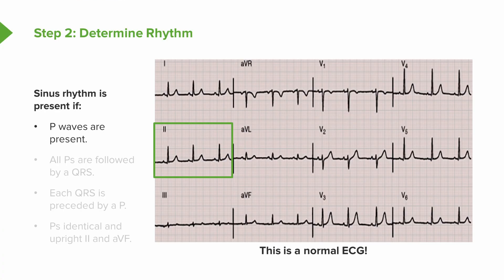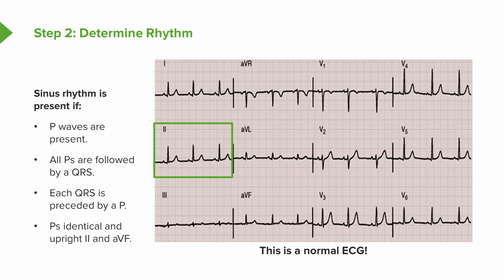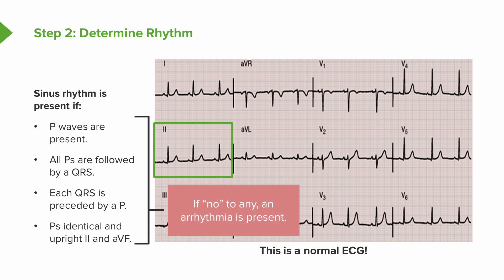You'll notice there's sinus rhythm: each QRS is preceded by a P wave, meaning the atrium depolarizes before the ventricle. All the P waves are followed by a QRS — there's no blockage of the beat as it goes down through the heart. Each QRS is preceded by a P, and the P's are all identical — upright in leads 2 and AVF, nice and narrow. If any of those conditions were not met, you'd be talking about an arrhythmia, and we're going to have whole lectures on arrhythmias later.